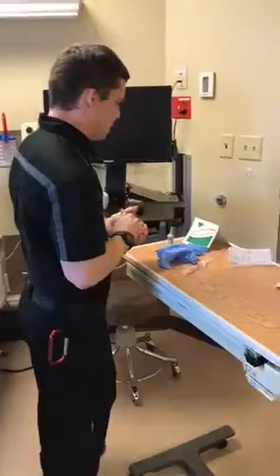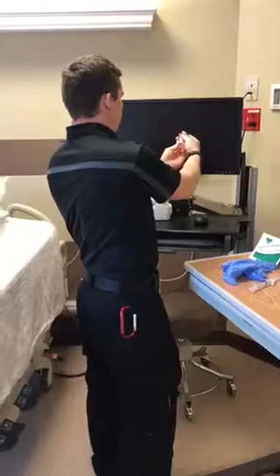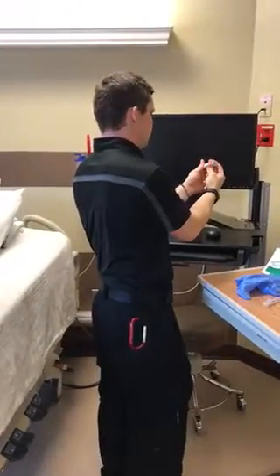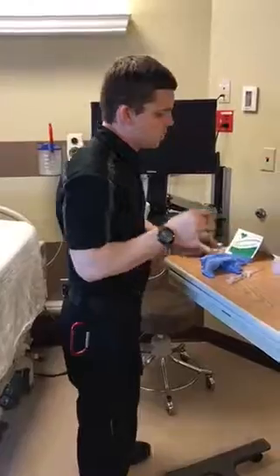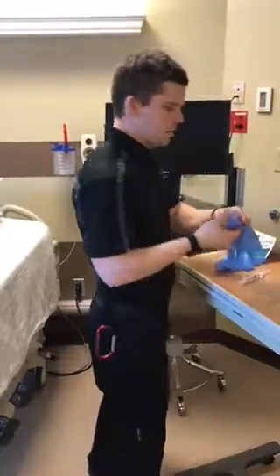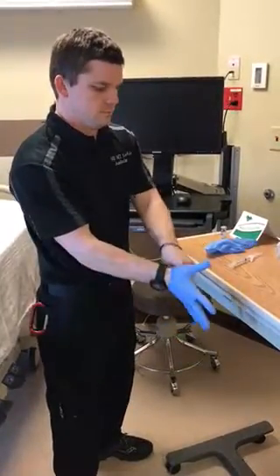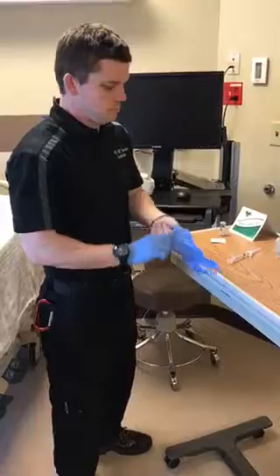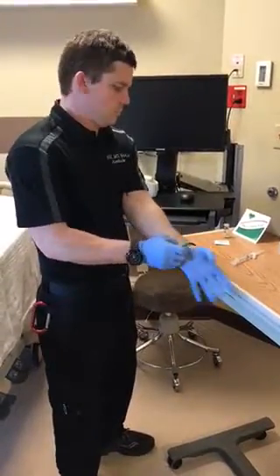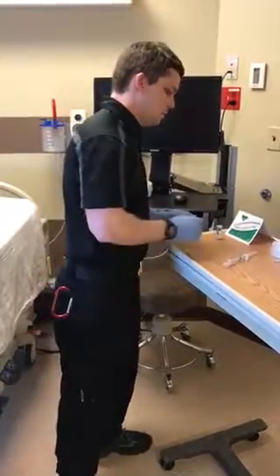So I'm going to go ahead and wash my hands now, dry my hands, and I'm going to do another check on the medication with the MAR, and it is the correct medication, is the correct date. I have the correct patient. I'm going to be using the correct route, which is IM, and the time is now, and then I'll be documenting it correctly later. I'm going to go ahead and put my gloves on. And then I will take my medication over here.